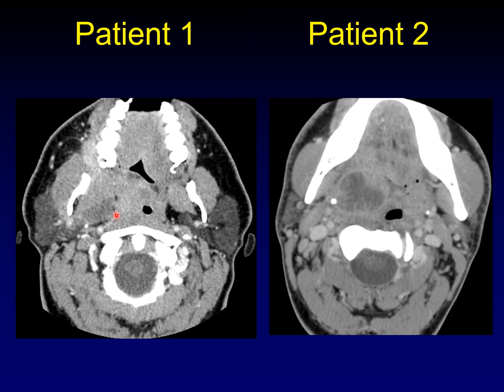That was true on the MRI as well as on this CT. So what arises within the parapharyngeal fat? Not a lot does that. You can get pleomorphic adenomas that arise within the parapharyngeal fat. You can get venous lymphatic malformations because those can appear anywhere in the body. And you can get second branchial cleft cysts. This is the second most common location of a second branchial cleft cyst — here within the parapharyngeal fat.